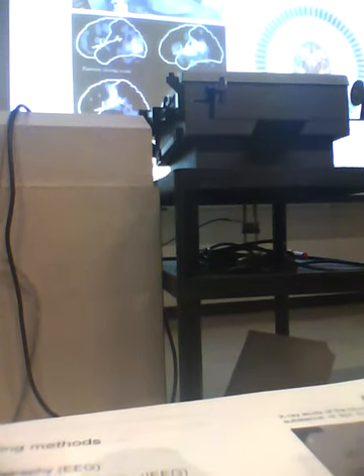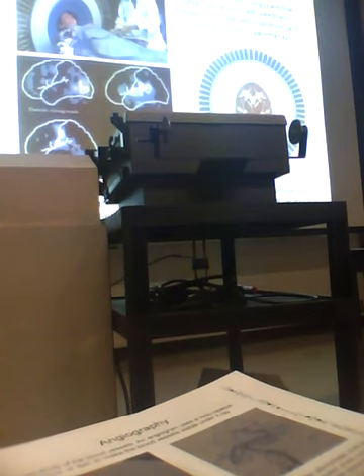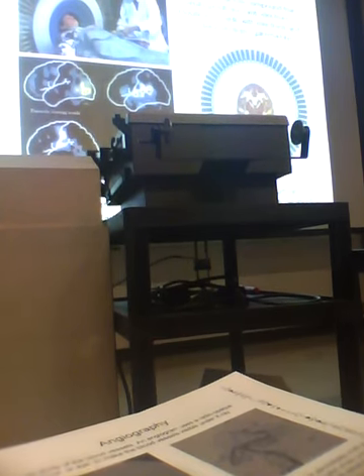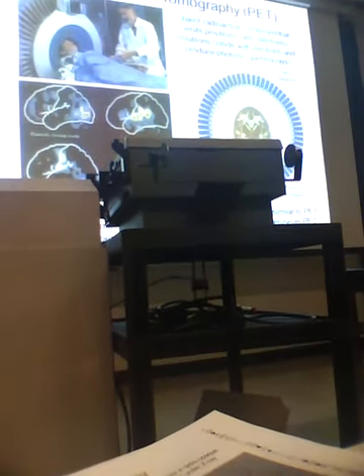Another one is positron emission tomography. Now this is a very expensive technique, and there are very few of these machines around, and it's being used increasingly in cancer care. We've got one of these machines in Edmonton, at the Cross Hospital. I'll describe how it works in a minute. It requires the use of radioactive isotopes. You have to have an isotope that emits a positron, and that's why it's called positron emission tomography.